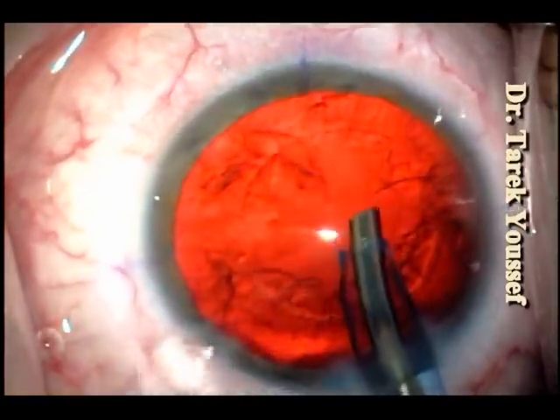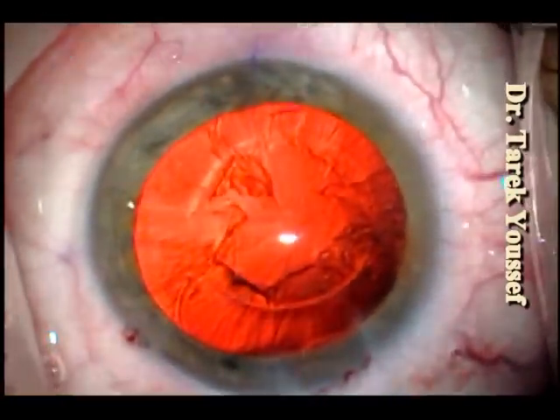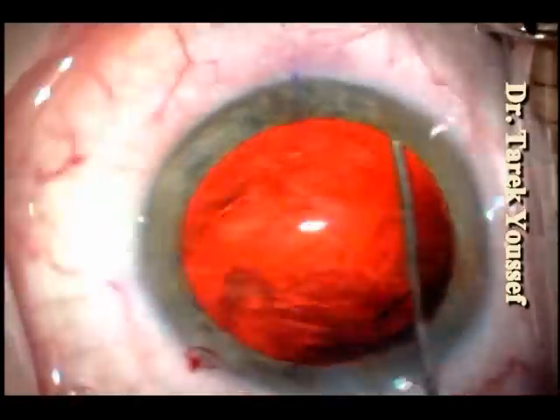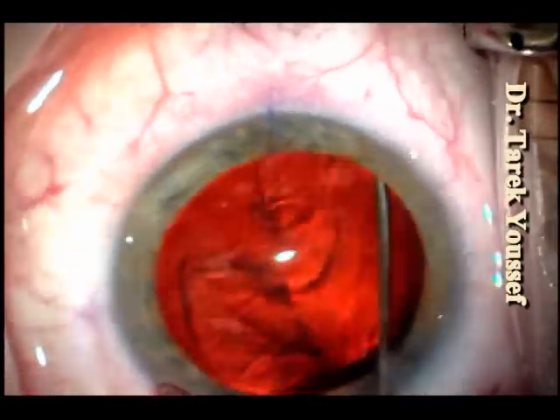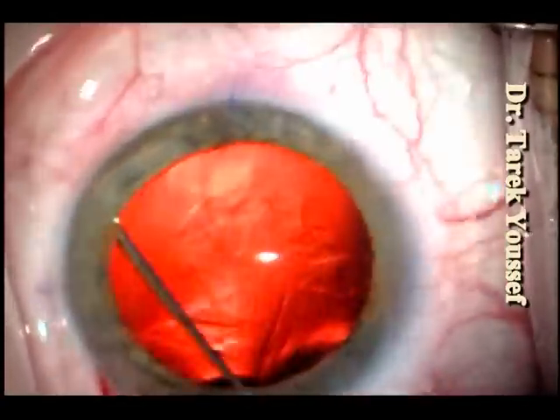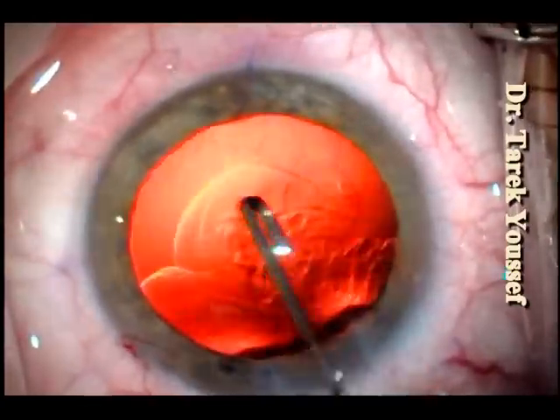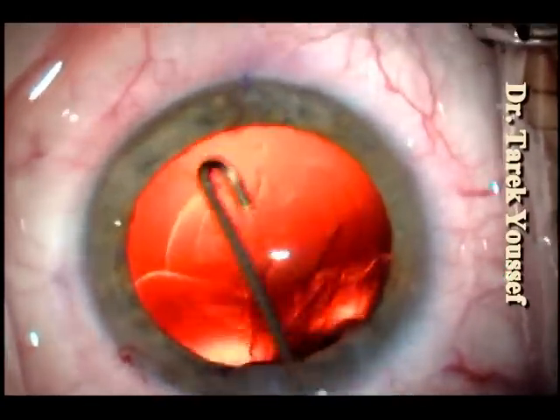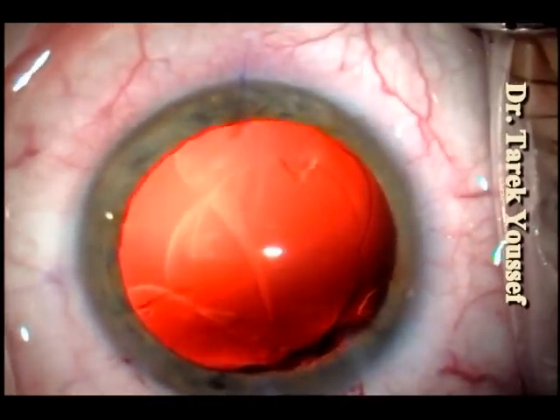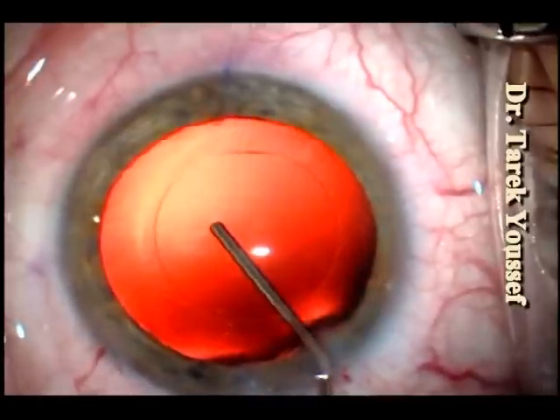We're done with the phacoemulsification and now we're going for the J cannula, which I use on a routine basis for almost everyone. We do an irrigation to wash out all the cortical material, which is much faster and much safer than doing irrigation aspiration and much more efficient. As you can see, in about 10 seconds I'm done with this step — much safer, no capsule tears, no torn capsules — and it's more efficient because you clean everything, even the stuff that you don't see.